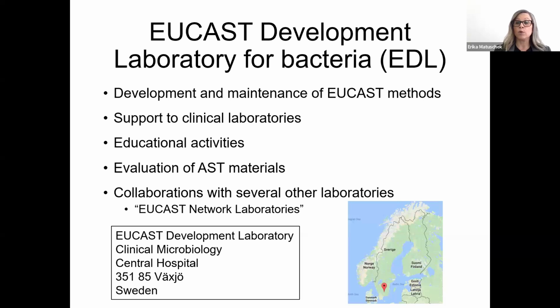We are responsible for developing zone diameter breakpoints and disk diffusion criteria, but we also develop reference MIC methods for organisms which previously were not included in the reference method. We work as the support unit to all clinical laboratories using EUCAST methods, and we help troubleshoot when you have problems.